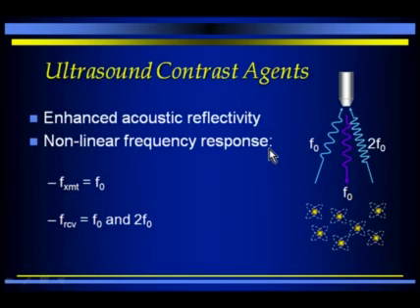Okay, so elastography is one method that has been described for looking for prostate cancer. That's still under investigation, and we're still awaiting the final analysis as to whether we can improve our distinction between cancers and normal tissue with elastography.